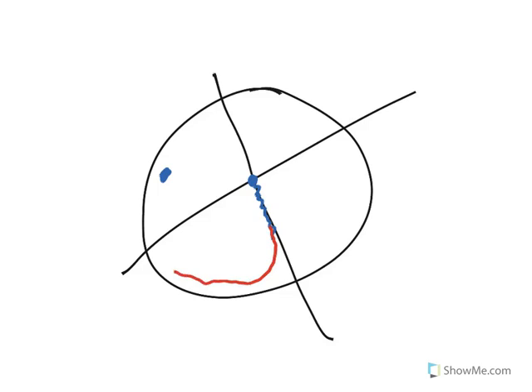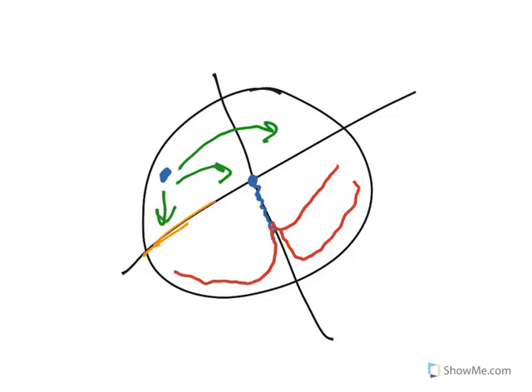So here we go. We've got our right bundle branch, and then here's our left posterior fascicle. Here's our left anterior fascicle of our left bundle branch. Remember, electrical activity, no problem here. SA node fires, SA node fires, so you get a really nice looking P wave. But because you have a complete electrical block, a complete heart block, now the QRS complexes are going to have to come from the Purkinje fibers themselves.